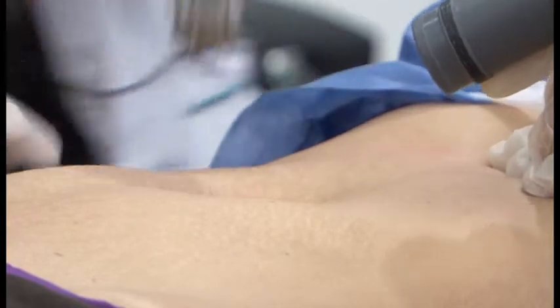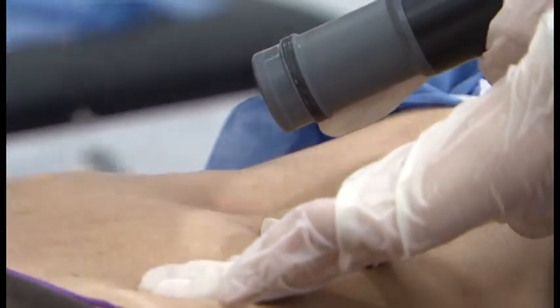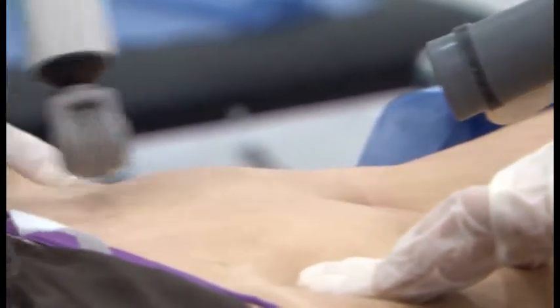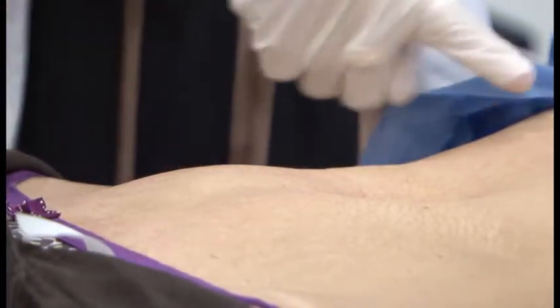Okay. Now I get a good reaction. Also here. Another 2 passes like this. Okay, this is what I want to get. Slight erythema. Can you see that? No, you can't. Oh, now you can see. Okay, you see the erythema? This is what we want to achieve. And it took about 6-7 passes to achieve this erythema.